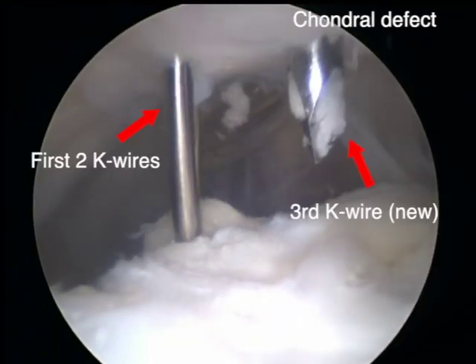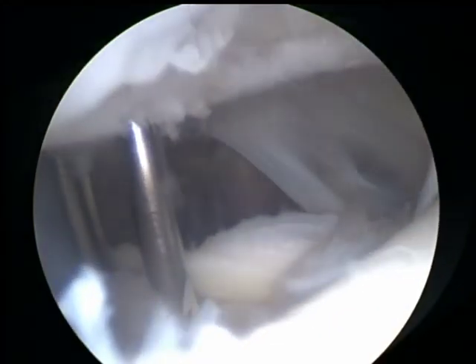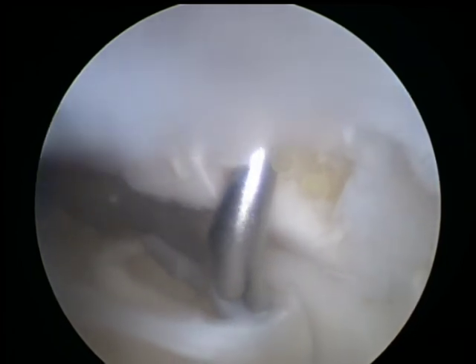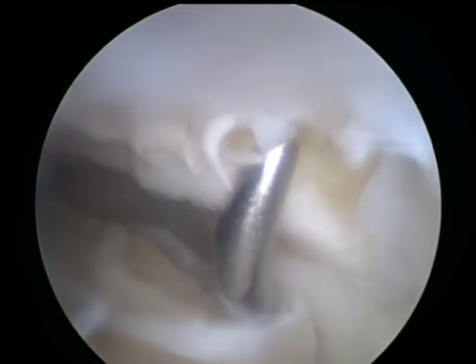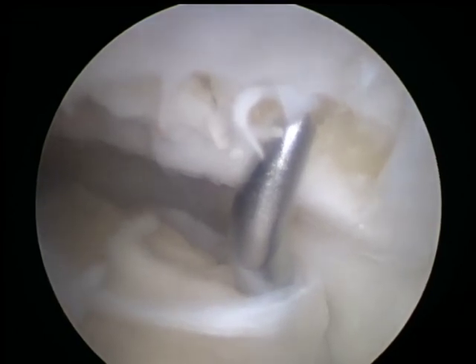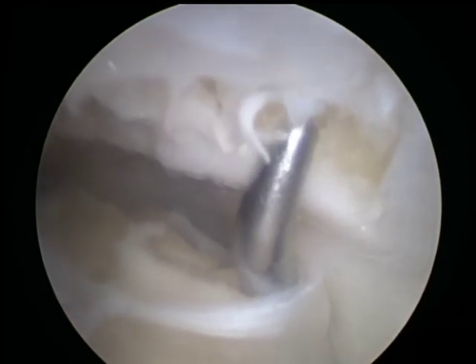Lastly, a new third K wire was inserted through the chondral defect, providing the best possible stability for the patella. The rest of the procedure follows the standard microfracture technique. As you can see, the patella is now firmly fixated, allowing the awl to penetrate and the operating view to be maintained.